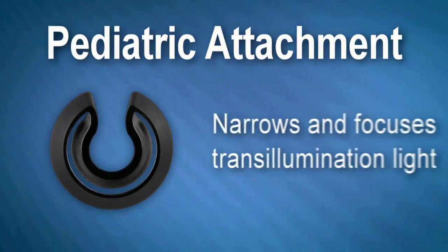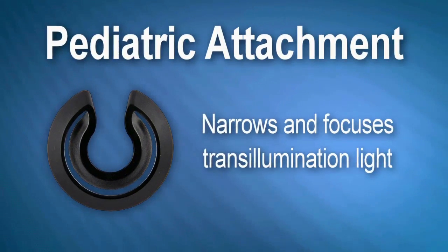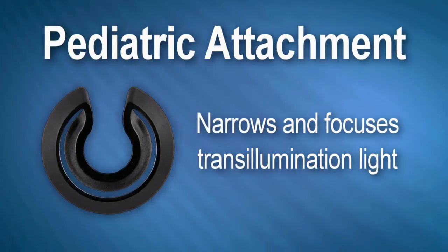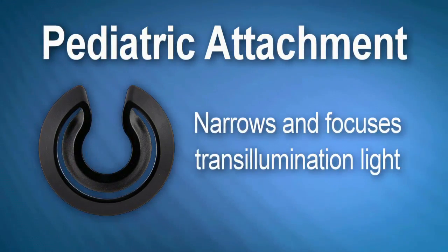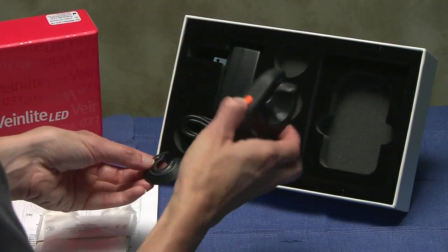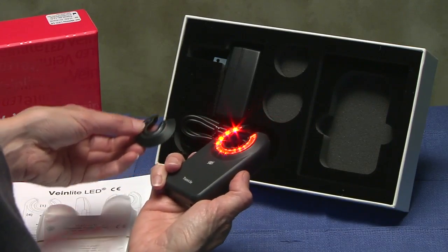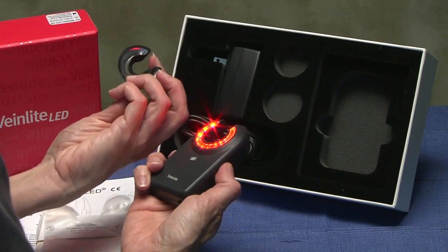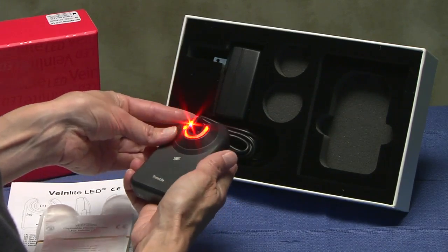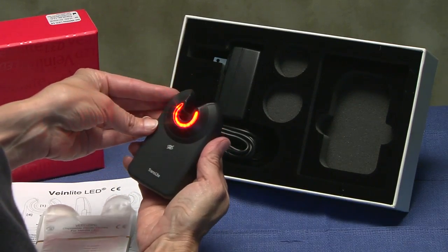The pediatric attachment is used to narrow and focus the transillumination light onto a smaller area more appropriate to infants and babies and elderly small bone patients. To use the pediatric attachment, align the opening of the adapter with the opening of the device on the side where the LEDs illuminate. Place the wider side of the adapter over the clear window. Press down and you will feel it snap into place.